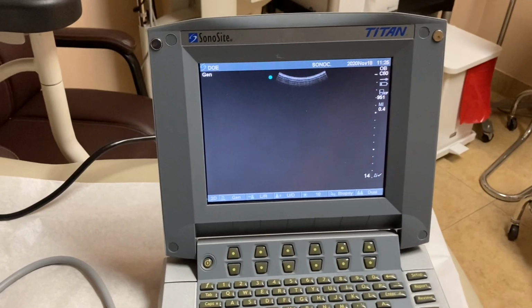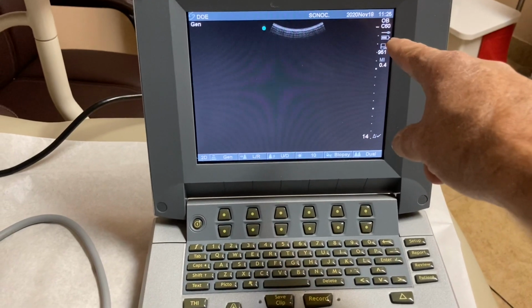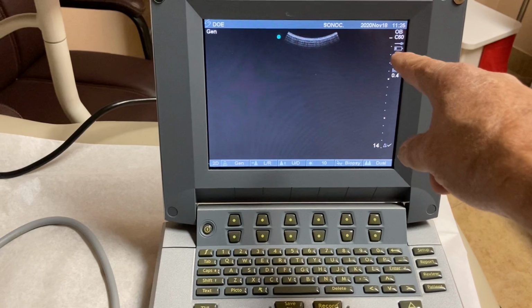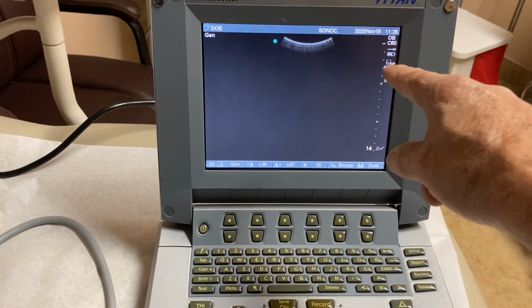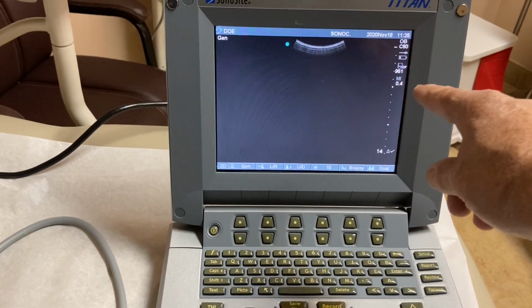Okay, so the power cable wasn't plugged in all the way, and that's why I wasn't getting the indication here. I heard a tone that I'm familiar with that told me the battery was low and it was going to shut off. That's a little warning tone, a little beep, beep, beep sort of thing, and then you kind of have to start looking around for why it is making that noise.